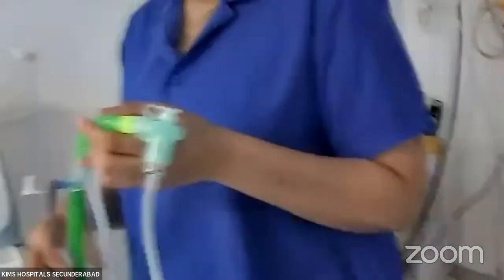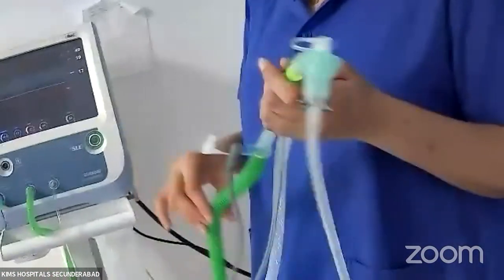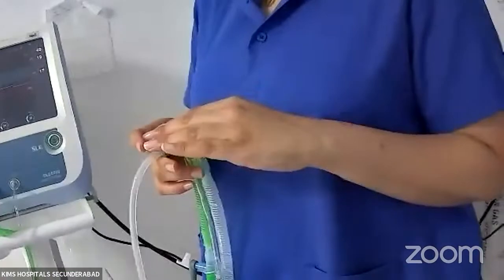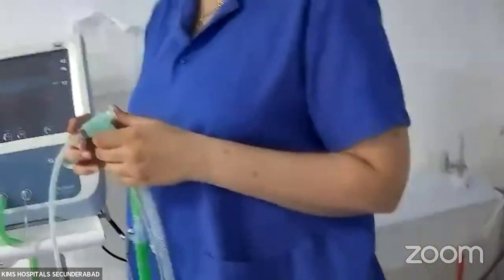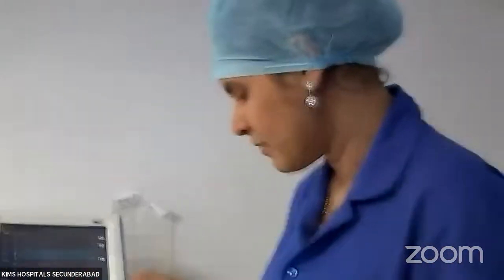So the important nursing precautions that are to be taken are to ensure optimal humidification by ruling out any condensation in the inspiratory tubings, and there should be a provision for closed loop suctioning wherever it is feasible, wherever our nurses are comfortable with the technique, because frequency of suction requirement might be more with high frequency when compared to conventional ventilation. So these are all the important aspects in high frequency ventilation.